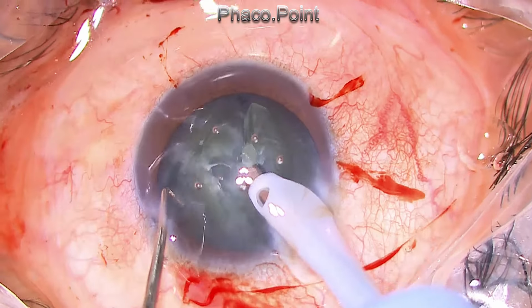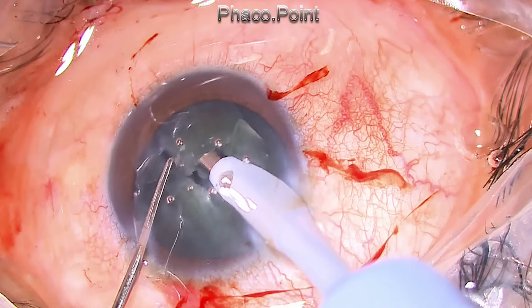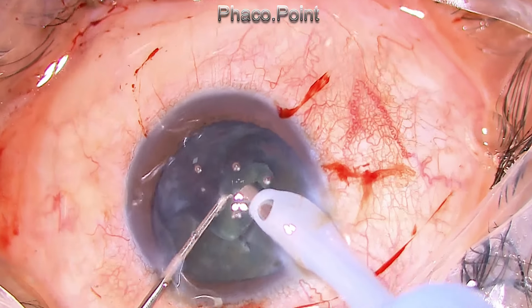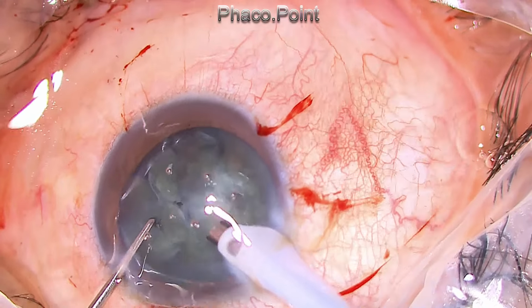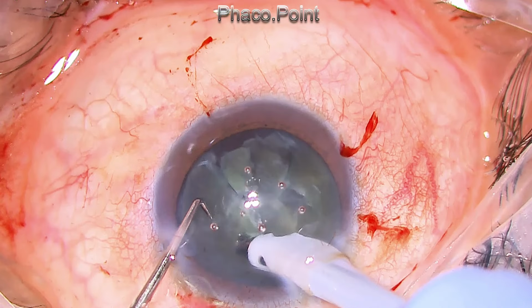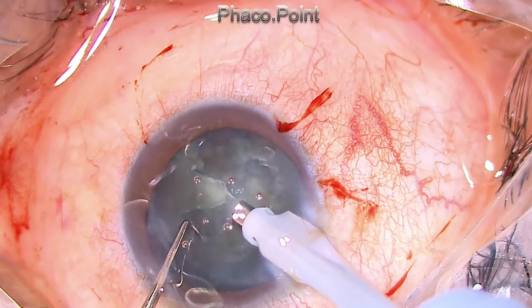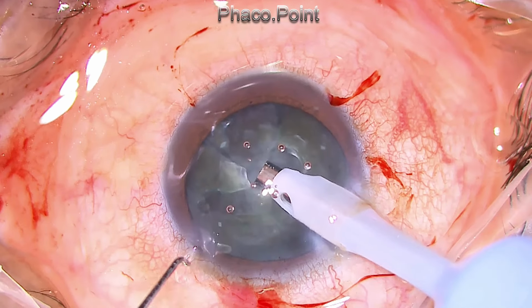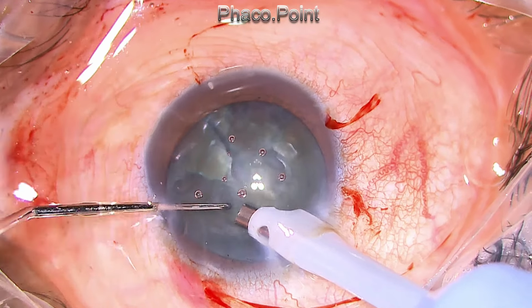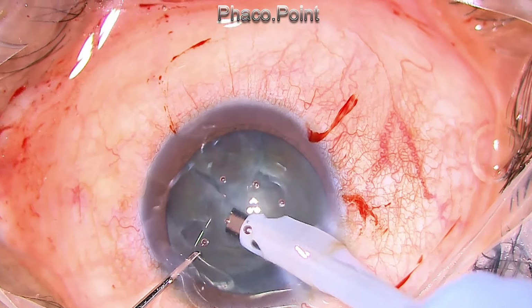Try an in situ kind of chop. The lens also was quite soft, it was friable, and simply with vacuum I was finding it difficult to dislodge the fragment into the anterior chamber, but eventually I managed to get one piece inside the anterior chamber. I then performed the in situ chop by holding on with vacuum and trying to create the chop, and I found that it was quite difficult, so I then switched from a chopper to a Sinskey hook. I attempted the rotation. That was wrong because this was putting a lot of stretch on the zonules. Therefore, I abandoned the rotation procedure.